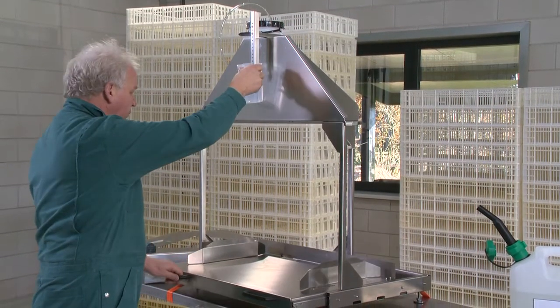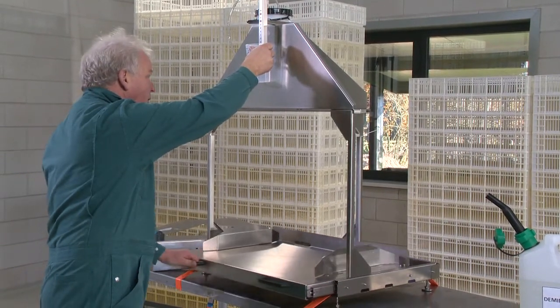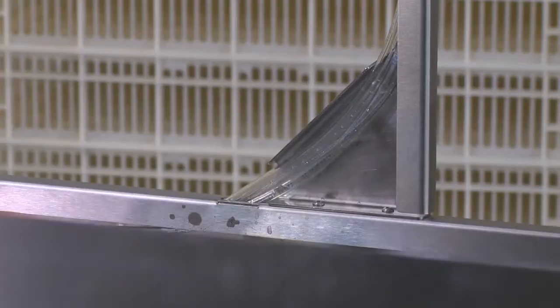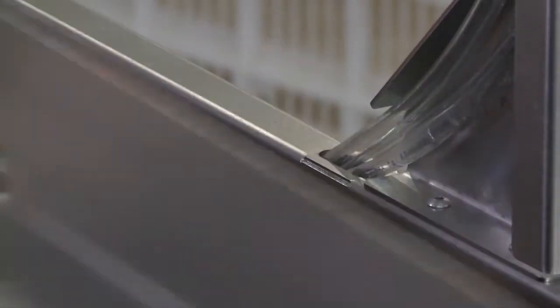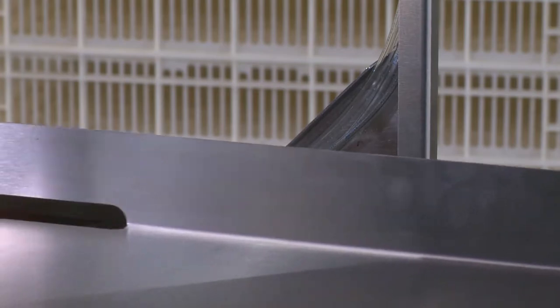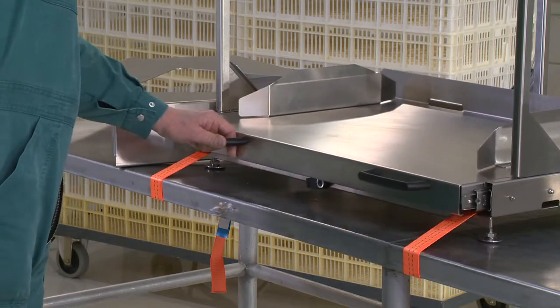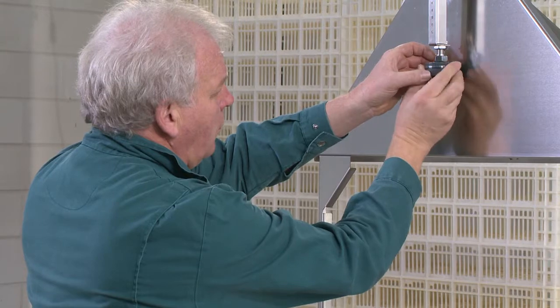To prime the Nobilis Spray, push and pull the drawer. The longer the stroke while pumping, the faster the air inside the tubes is replaced by liquid. You can monitor proper functioning of the device by frequently checking the liquid flow in the tubes connected to the nozzles. In addition, you can check the volume delivered in 10 strokes by using a measuring jug. When liquid is leaving the spray nozzle, the syringe is primed and ready for operation.